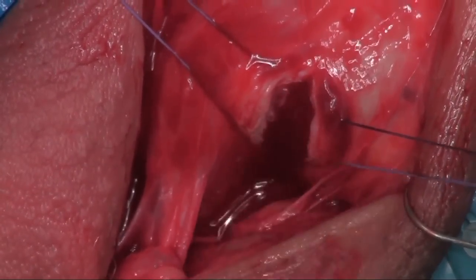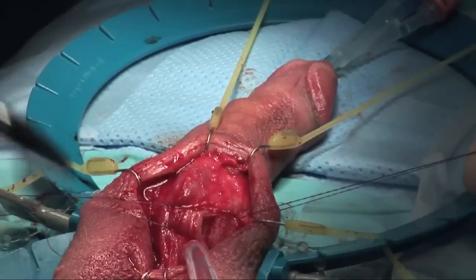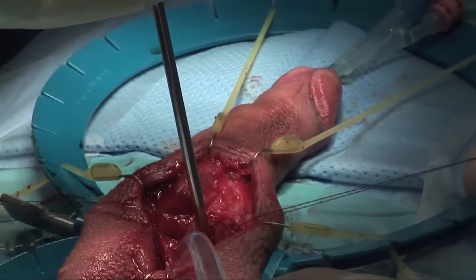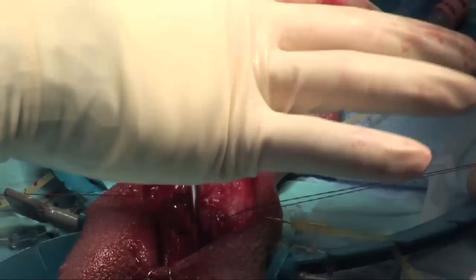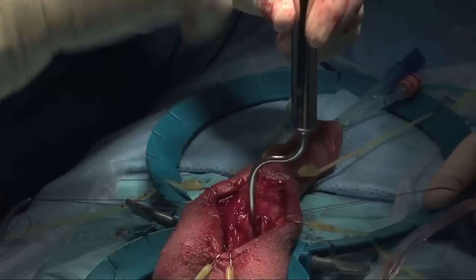Here's the important thing — one of the most important things is stay lateral. Here you're going to see me, even when I'm dilating proximally, I'm staying lateral. I go all the way down to the bone. Remember, the cruces separate down proximally, so you've got to get in that lateral cruce when you dilate.